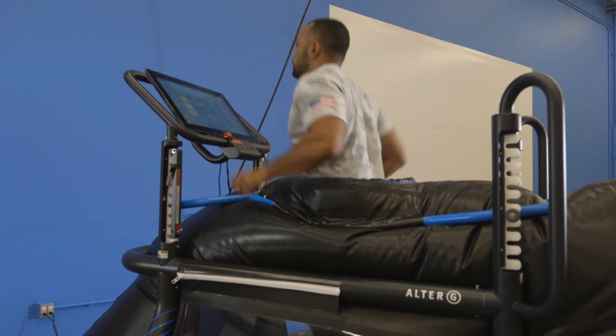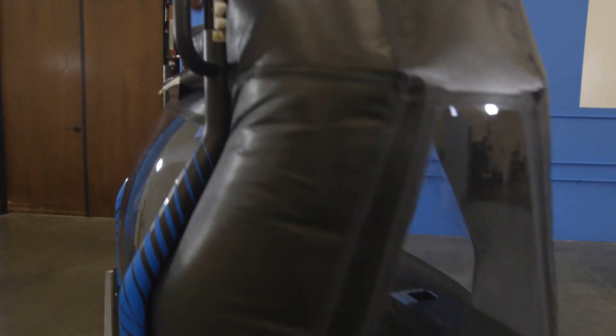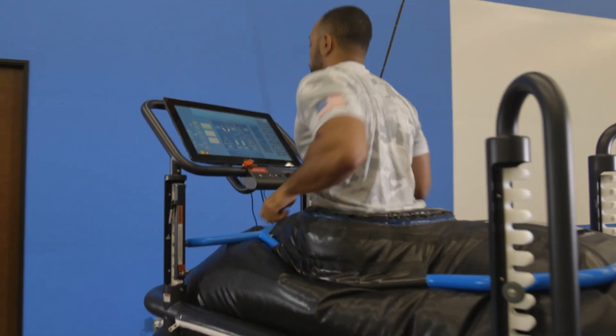Every journey starts with a map. AlterG's new Pro 500 anti-gravity treadmill gives athletes that want to train harder and start their recovery from injury sooner a new way forward.